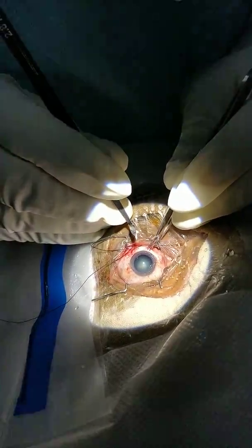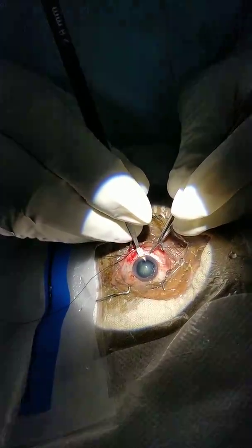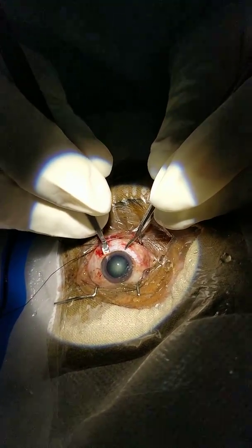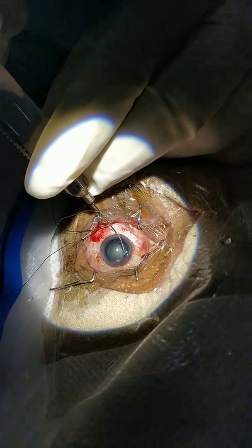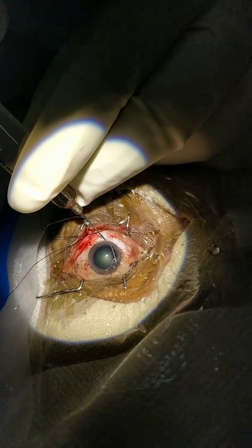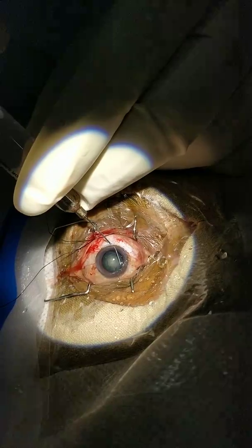Now through the keratome I will enter the anterior chamber. Now I will do hydrodissection and delineation. This is one of the very key steps of any cataract surgery, because if it is done well the further steps become very, very easy.